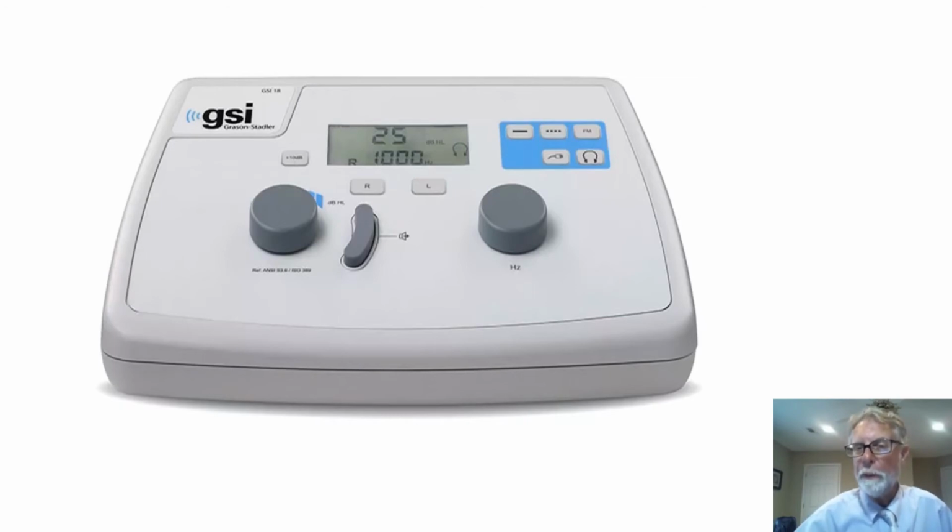Below that in the blue, the lower 2 buttons are to select either inserts or headphones. On this particular audiometer, you could actually have both, and you would choose which ones you're using because they are calibrated differently. Got to make sure you've got what the audiometer is calibrated for. And the audiometer should be electroacoustically calibrated once a year. So there's all the controls on the front panel of a typical audiometer.